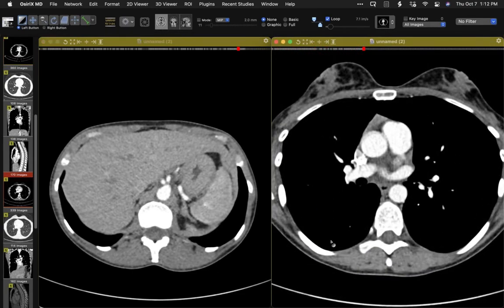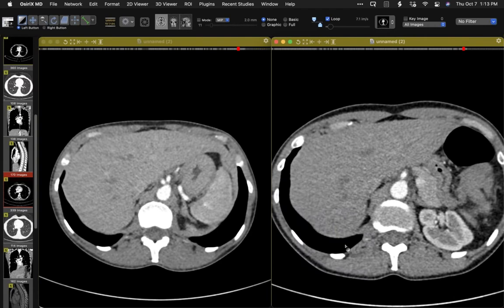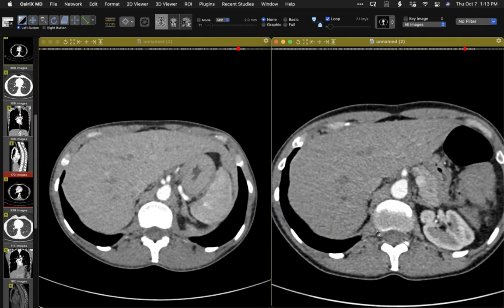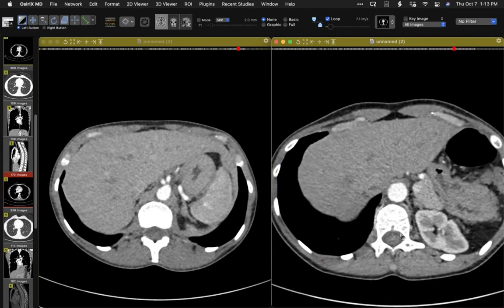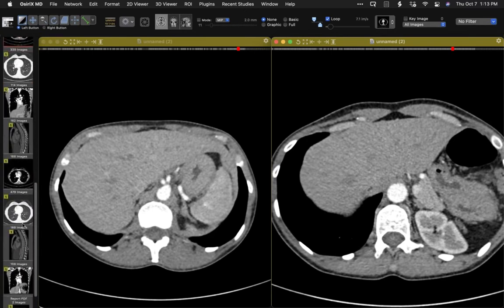And now, of course, that left hemidiaphragm is going to be up, but let's go just down more inferiorly to see the posterior right hemidiaphragm and the region of the crus. And then if we look for the posterior hemidiaphragm and the crus, now we can see that there is definite asymmetry and that the diaphragm muscle thinning involves not just the anterior hemidiaphragm, which I'm not showing you, but also involves the crus. So we definitely have findings of diffuse muscle atrophy involving the left hemidiaphragm, new from before.